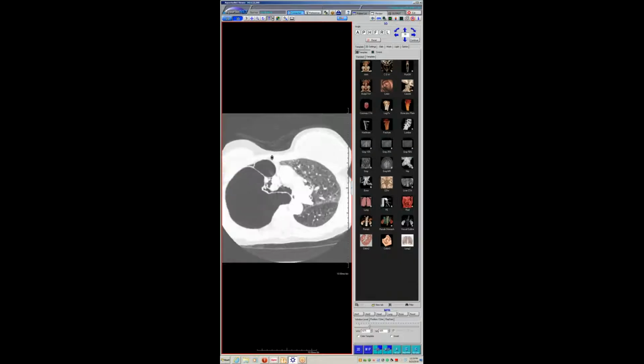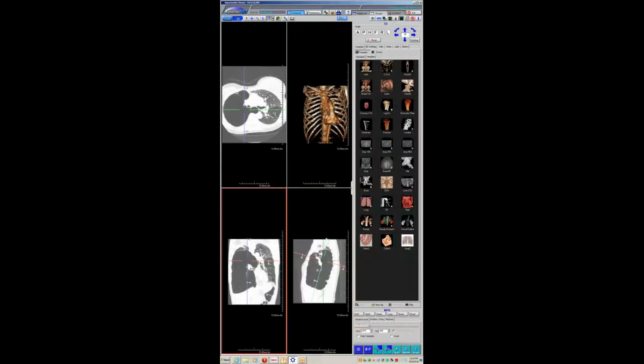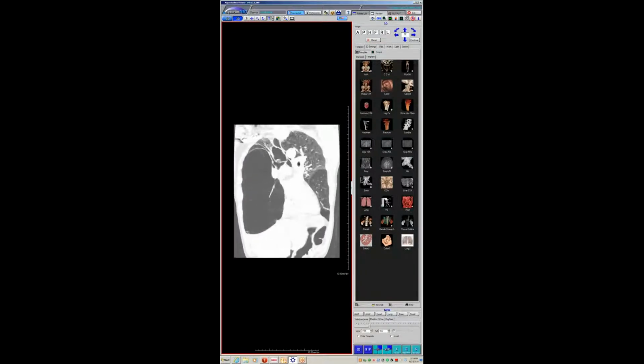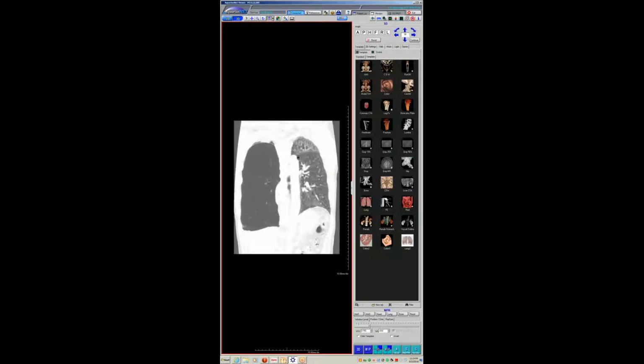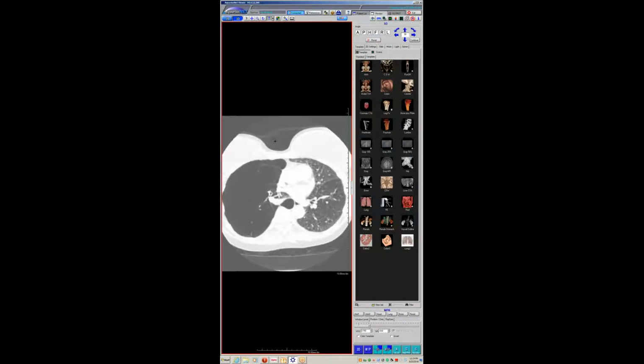What do you guys think? Do you think that this is somehow all... I was raising the aspect of some sort of congenital lobar emphysema, although I know some of you guys have shown cases in older patients. I just haven't seen one before. Do you think it's all just really bad panlobular emphysema from some other cause, or do you think it's smoking, or what do you think?